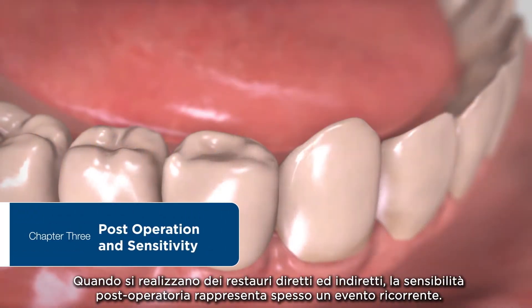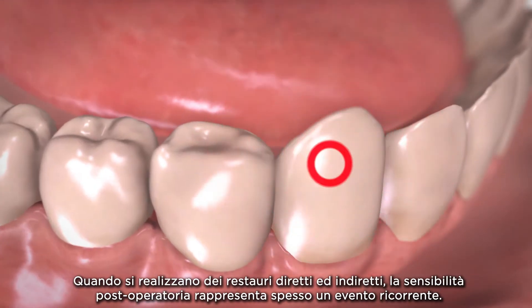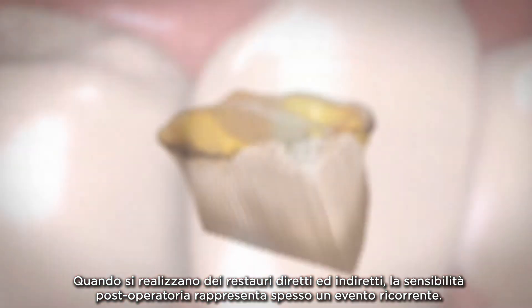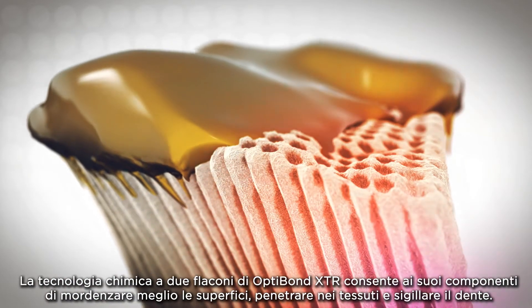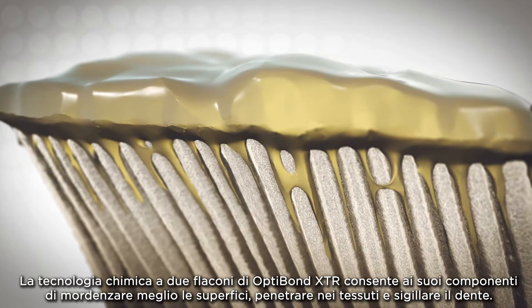With direct and indirect restorations, post-operative sensitivity is a common troublesome event. XTR's two bottle chemistry allows the bonding agent to better etch, penetrate, and seal the tooth.